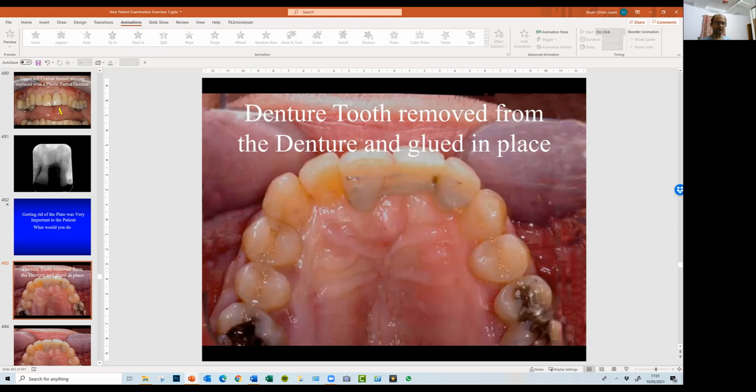Why do you want to extend it to the incisal surface? Then you pick up the acrylic that's on the occlusal surface that the wires are attached to. You put the acrylic onto the patient's occlusal incisal surface, and the wires go in place on the palatal side. Having etched the surfaces, you then glue the wires to the teeth with flowable composite. Okay, got it. You then cut off the wires to the length they are.